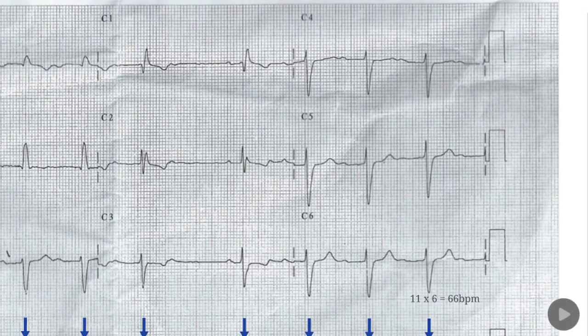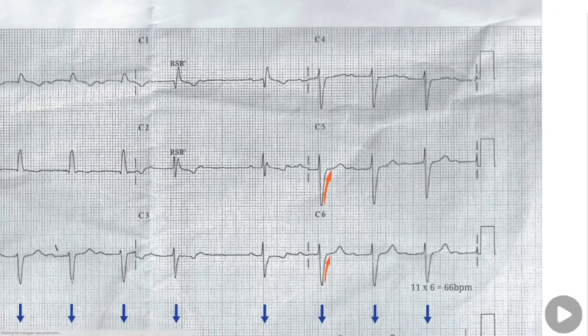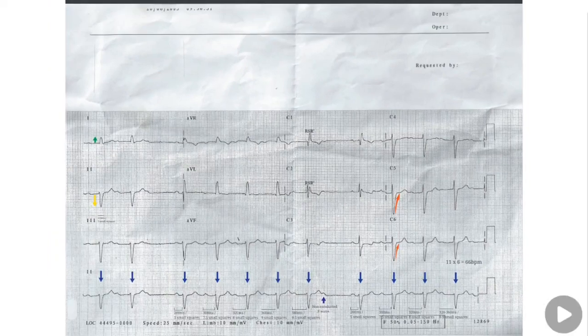In precordial leads, this ECG is showing abnormal QRS complex morphology with RSR pattern in V1 and V2, and slurred S wave pattern in V5 and V6, thus showing a right bundle branch block pattern.